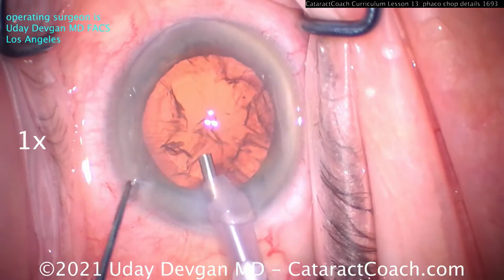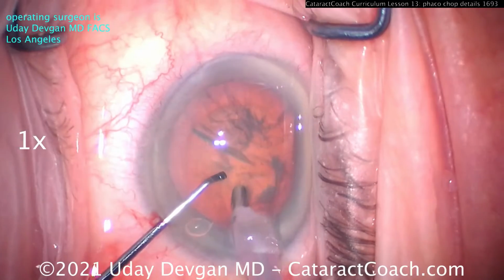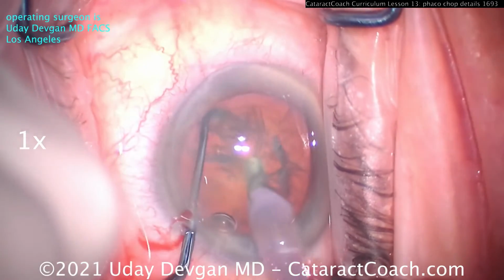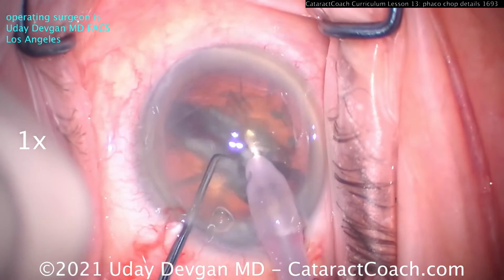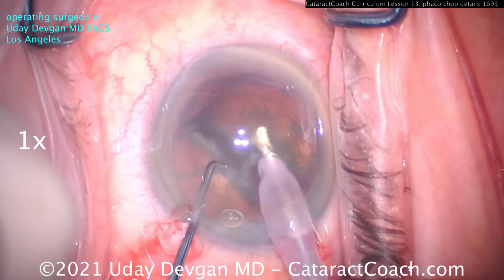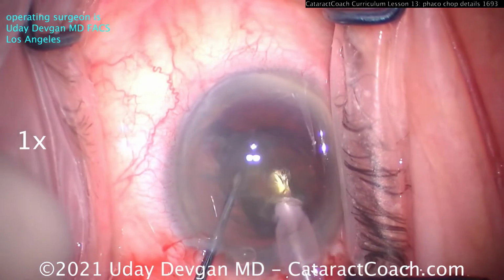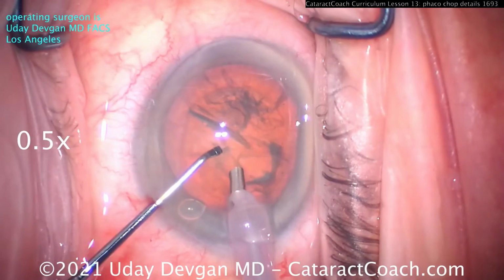Nothing to it. Let's watch that one more time. There we go. Embedding it, this is real time. Chopper goes into the nucleus too, and now split, and then propagate that chop, hold one piece away while the other's brought up. And let's show you that same step again at half speed.